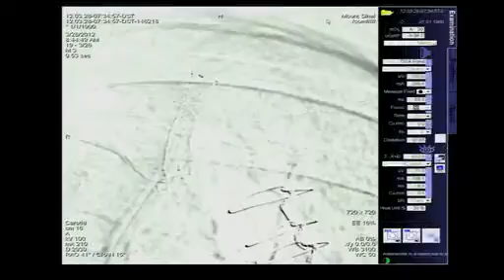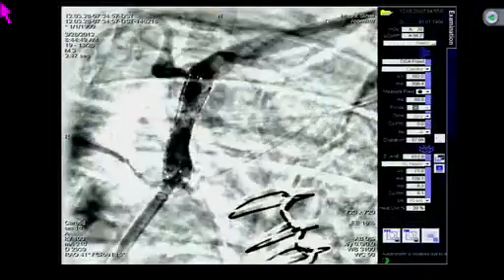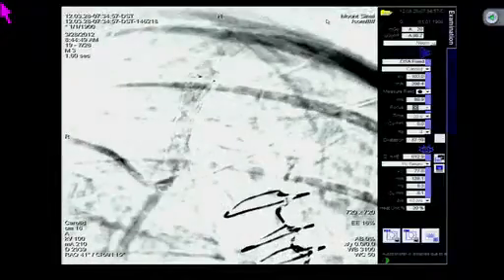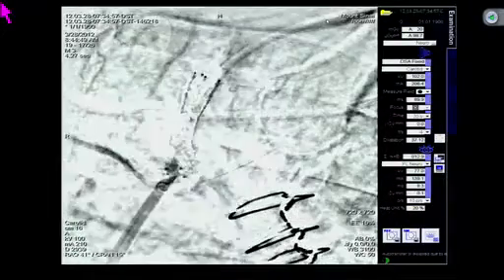No, that is absolutely acceptable, except on the second view, you didn't really have much of a dent. I would definitely not post-dilate with an 8mm balloon. That is definitely going to be way too much. You have a 6mm balloon in there that you can use if you want, at a very high pressure. I don't think that's going to cause a problem with perforation. Right. But given how the second view looks now, I'm also underwhelmed about post-dilating. And we have a very acceptable result, we have no gradient, so we resolved our problem.